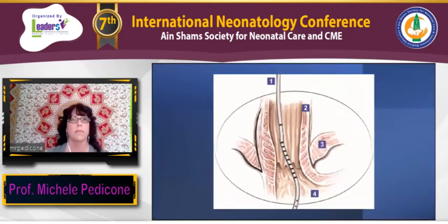Here is where you can see the catheter in the esophagus. Number 2 is the esophagus, 3 shows the level of the diaphragm, and 4 is the gastric mucosa. So you can see most of the electrodes at the base are right there at the diaphragm, so they are sensing that electrical activity.